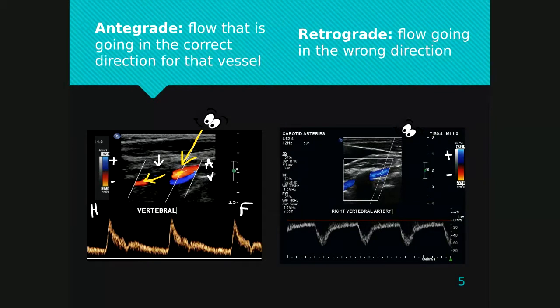The second vessel is filling in blue, which, if you look at your color map, is the positive color flow assignment. So that means this bottom vessel, the blue one, is going in this direction because the two arrows are going to hit, and that's a positive shift.